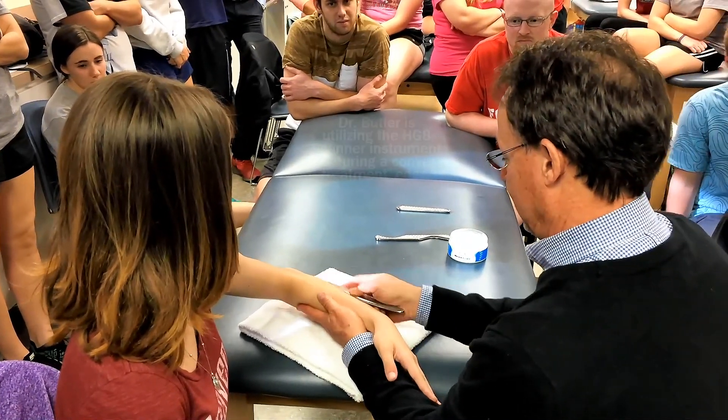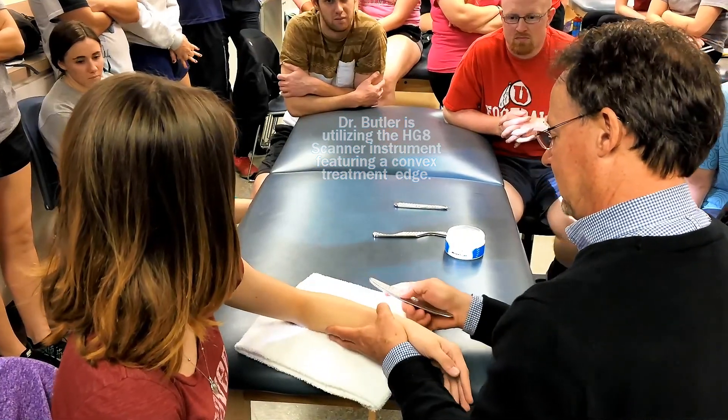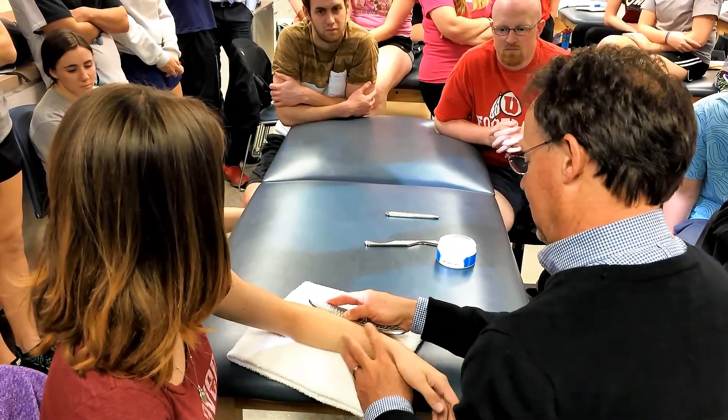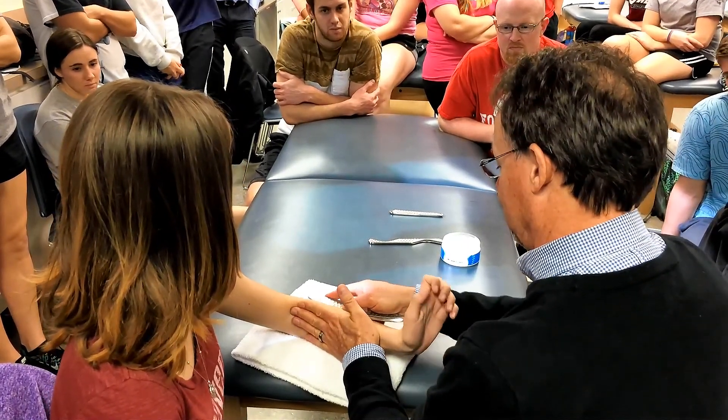I can fan across the area, but I'm going to show you a neat little trick. I can take the edge of the tool and embed it down in the tissue, and have her move her forearm up and down, so she's actually moving the muscle bellies underneath the tool.